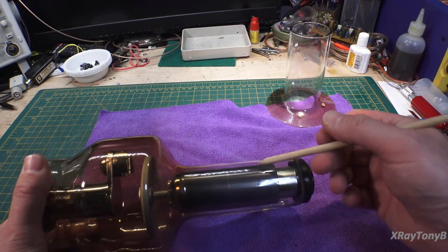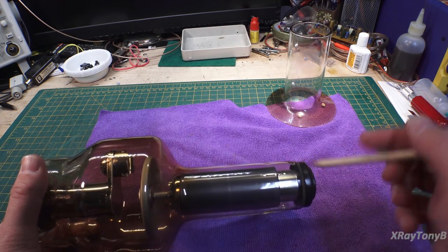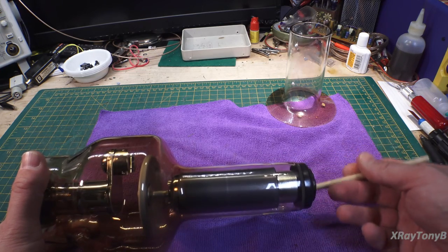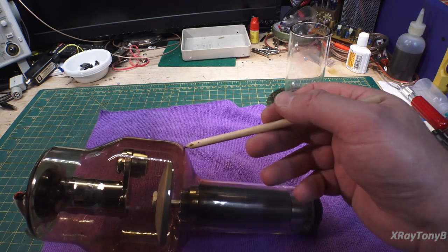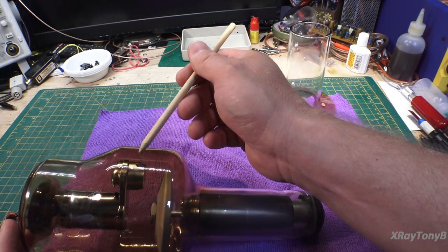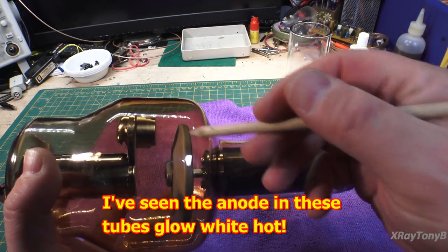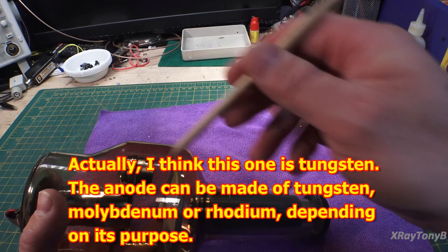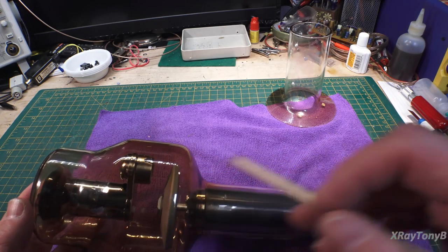And I've seen these, and the reason there's a bearing in here is because this whole anode rotates. It can rotate at two different speeds, either 1,725 RPMs, or I'm sorry, 3,450 RPMs, or approximately 10,000 RPMs. And the reason that they rotate the anode is to spread the heat. When you're running these at this high energy, these will get very, very hot. And actually, the electron beam that creates the X-rays can get so hot, it can burn a hole right through that. Even though this is a large piece of tungsten in here, it will still burn. Or molybdenum, I'm sorry, it's molybdenum. It can burn right through it. So by rotating that anode, by spinning it at a high speed, you're spreading that heat across this whole disc and helping it to dissipate.